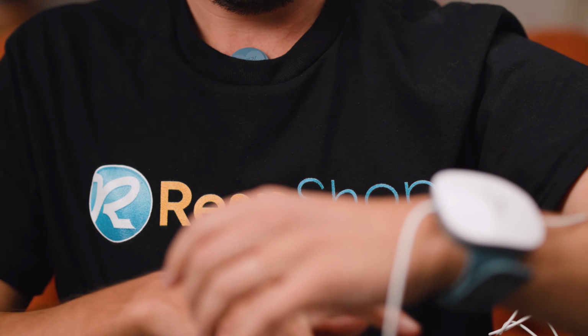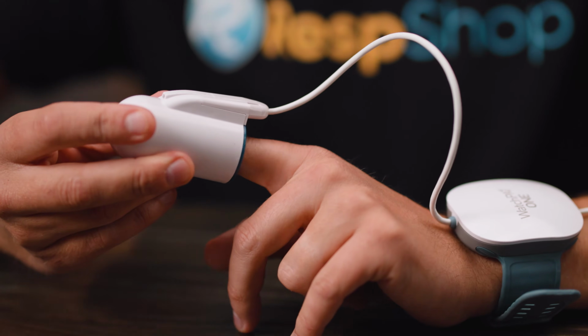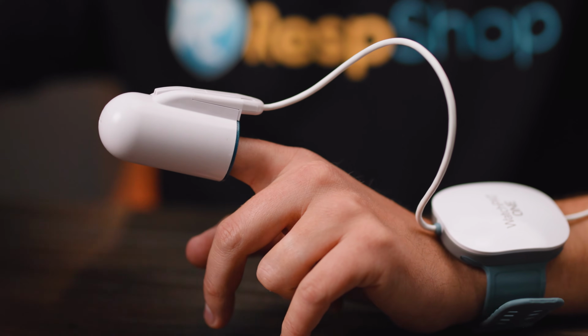If you are getting the sleep study done through your insurance, you should first check that they're willing to cover a lab study, as many will only cover one after an in-home study has already been conducted and the results suggest further study is required. Also, lab sleep studies require a referral from your doctor and may have a long wait list. And even once you've completed the study, the data can take a while for it to be analyzed. So if urgency is key, go with an at-home sleep study.